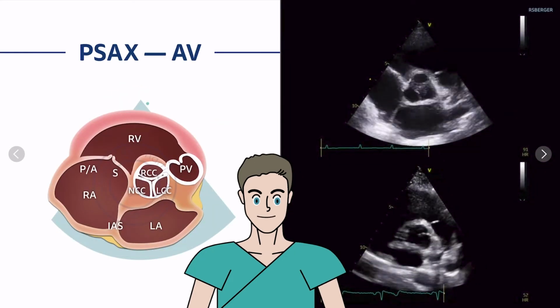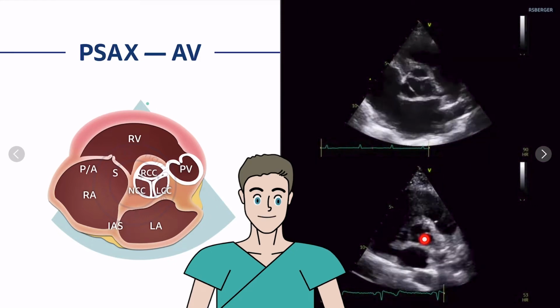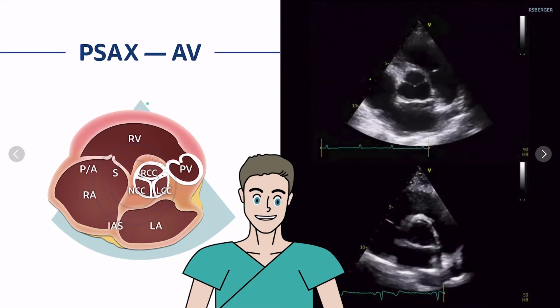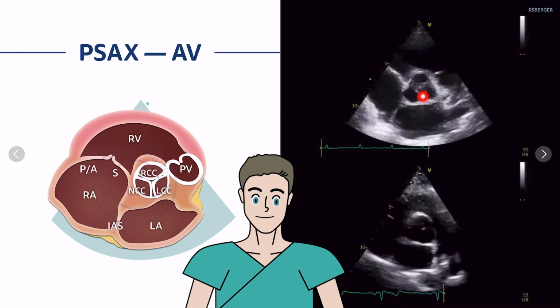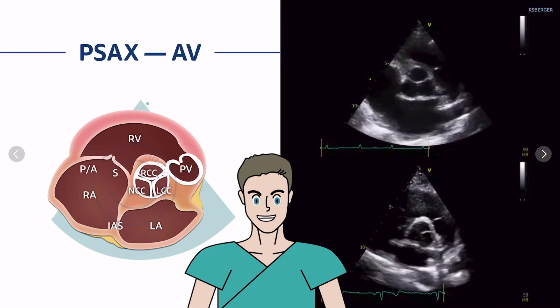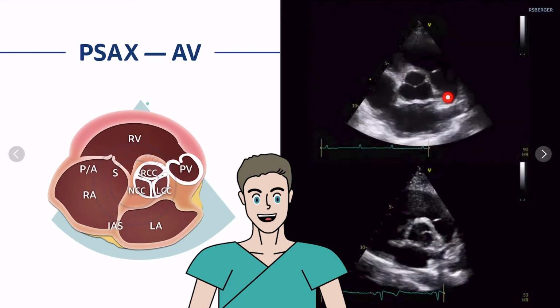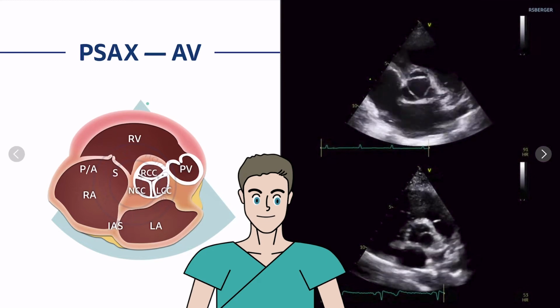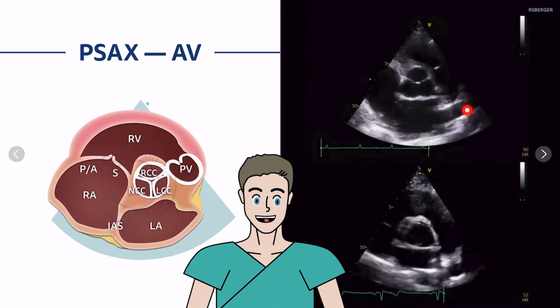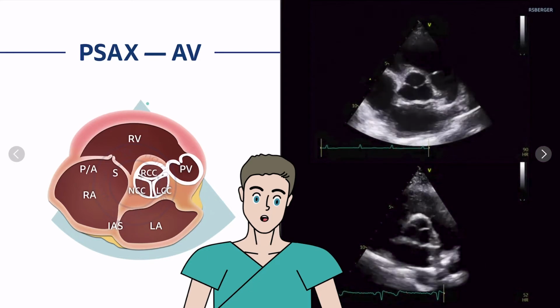Let's have a look how this presents in a B-mode image. Here you can see the aortic valve in the center. Same holds true here. Not all the time you have this perfect image quality, but here you can differentiate quite nicely the right coronary cusp, the left coronary cusp, and the non-coronary cusp. The left atrium, the right ventricle, the right ventricular outflow tract, and this is the pulmonic valve, and this already the pulmonic trunk. Note that there is another structure we can differentiate. That's the left atrial appendage seen over here. So even in a parasternal short axis view, you can visualize the left atrial appendage.